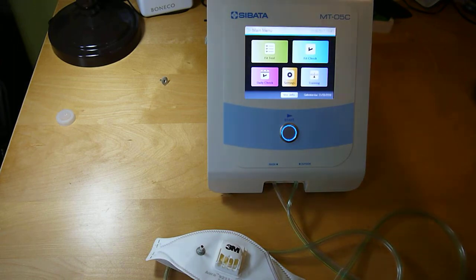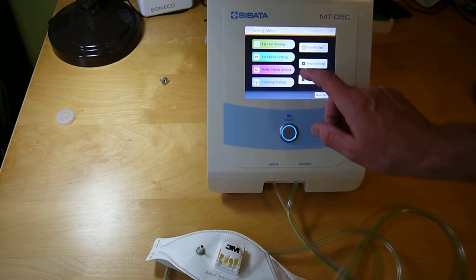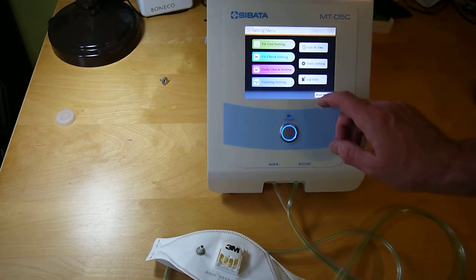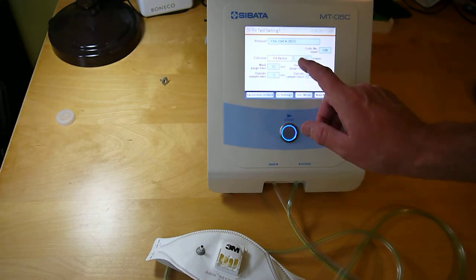To fit test an N95 respirator, first go to settings and fit test settings. Make sure the fit factor is set to 100 or more, so you leave it at 100.